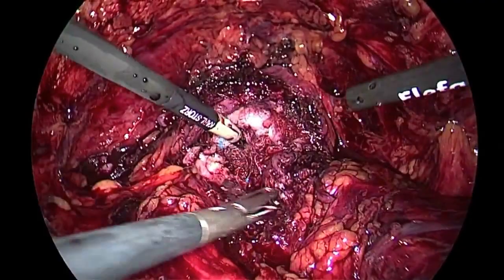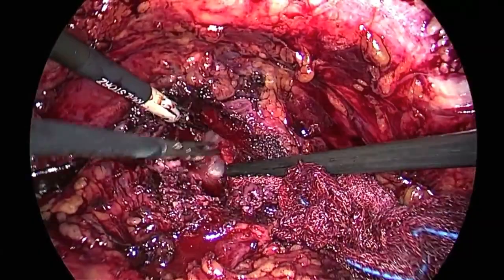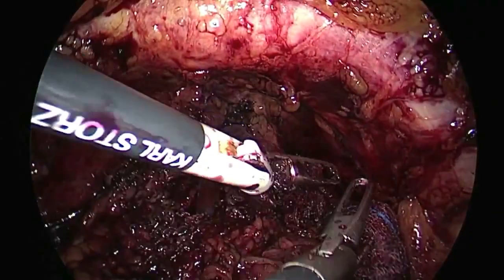Okay. Can you give me the catheter, please? Can you introduce the catheter, please? Okay, push in. Catheter, please. Introduce the catheter. As you can see, the catheter is in the bladder now. Okay. Can you close the catheter with the clamp? And now I close the bladder. Okay. The capsule.